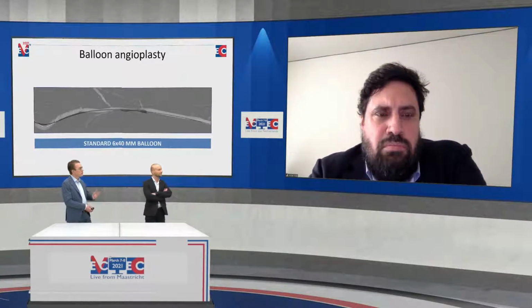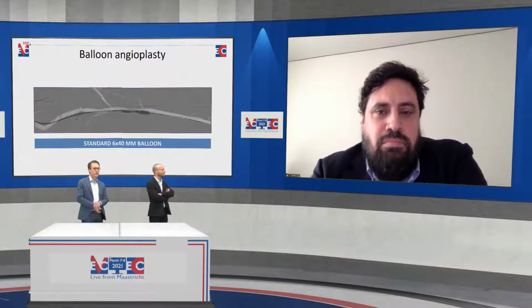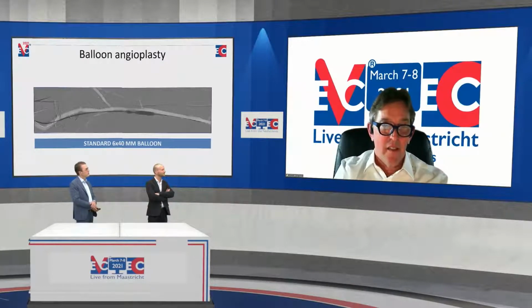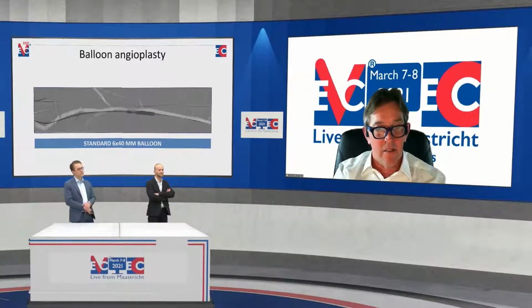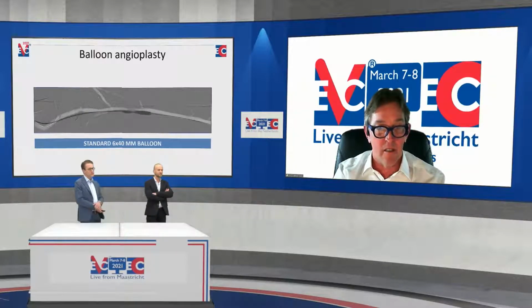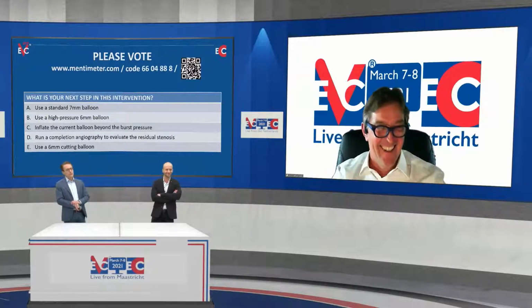Dr. van den Berg, could you maybe comment on the angiography? Yeah, what you see here happening is what you oftentimes see. Part of the balloon is not opening up. And that is, of course, I don't know how much pressure you're giving at this point. But if you see this, then I think you don't go further. We have the question just arriving. Yeah. Okay. So indeed, the balloon is not inflating fully. So I think that we should now think about our next step.